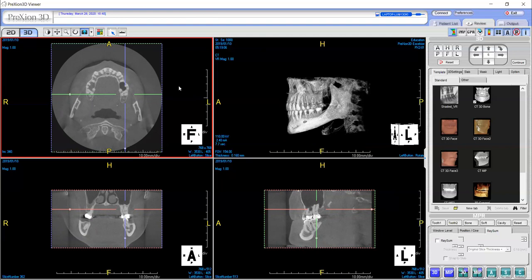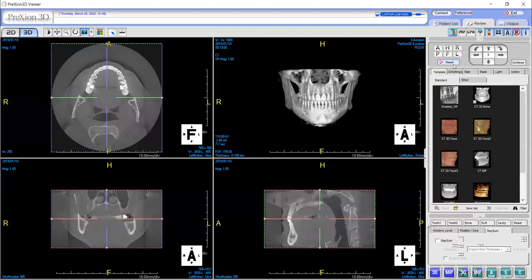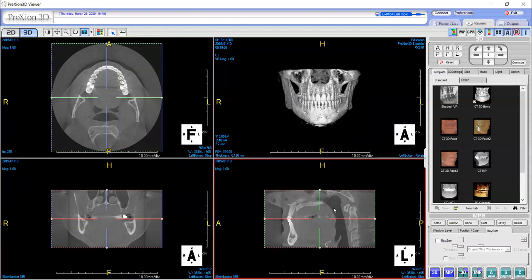Let's click the reset button on the upper right corner to bring the crossbars back to their original position. Important to note: when utilizing the reset button, if you have previously traced a mandibular canal or placed implants, the reset button does not get rid of any of your work — it simply resets the crossbars to their original position. Now we're going to go back to the toolbar section to look at window level, pan, and zoom. The window level is going to adjust the contrast on your CT images, and on your 3D image it's going to make the image go from a bony to a tissue view.